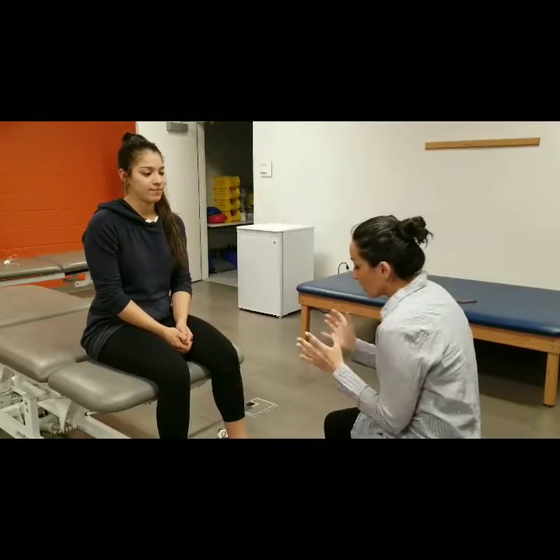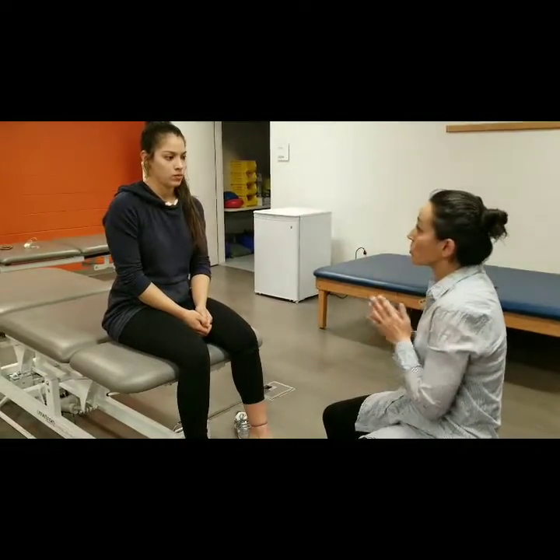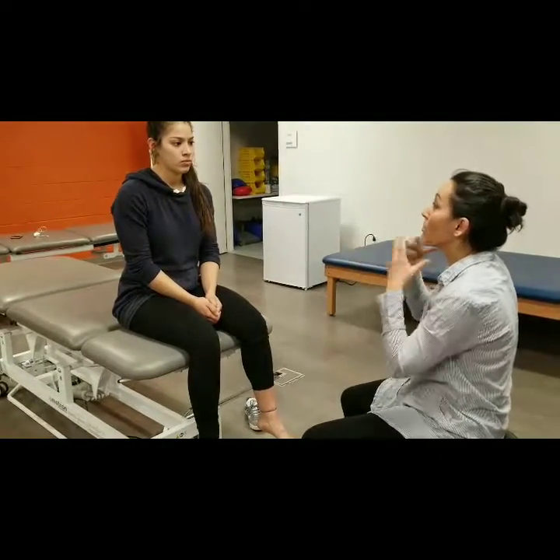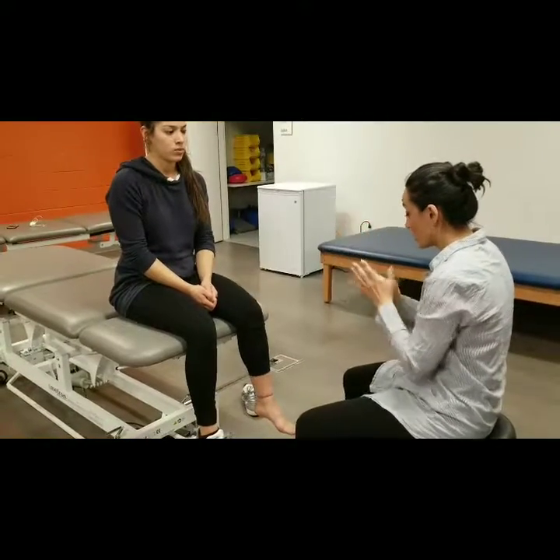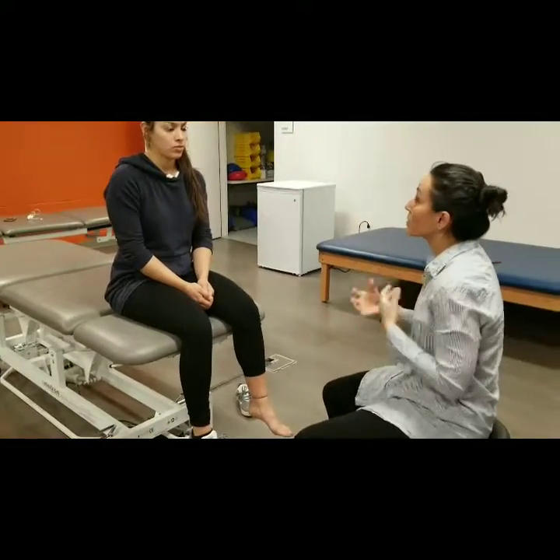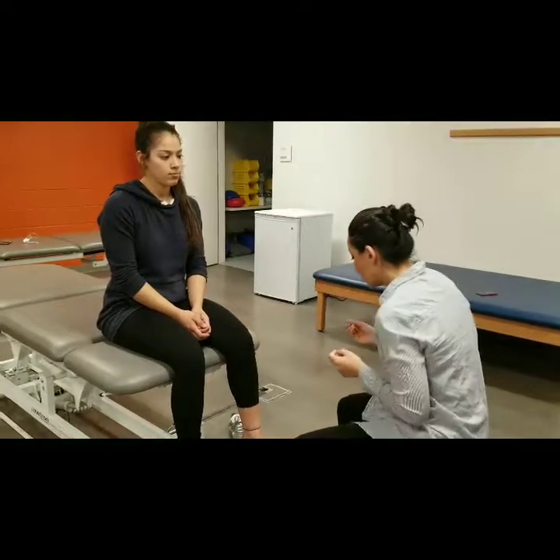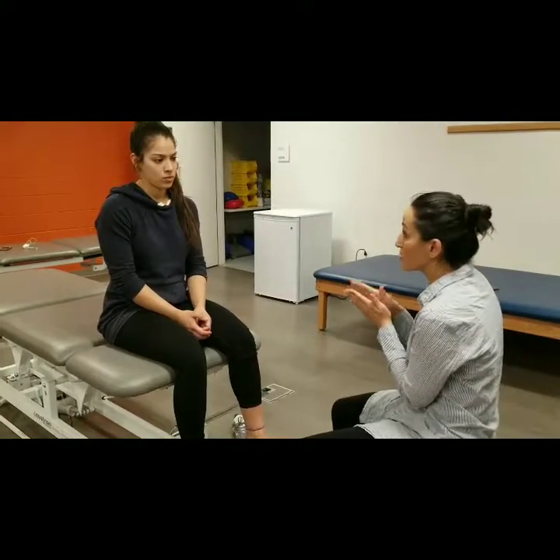When we put the wrapping on your ankle, it's going to help the blood go back to your heart and back through your system, so you can have more efficient blood circulation in your body. But when we do the wrapping, you're going to feel a little bit of pressure, just a little bit.